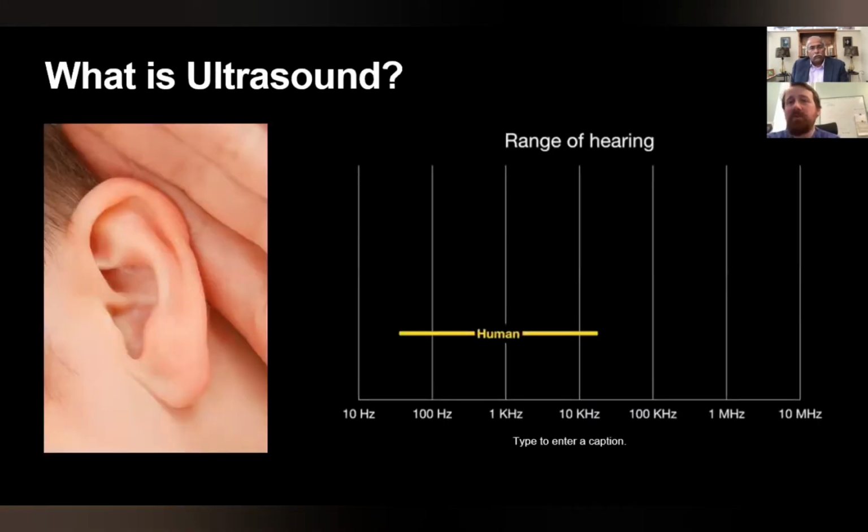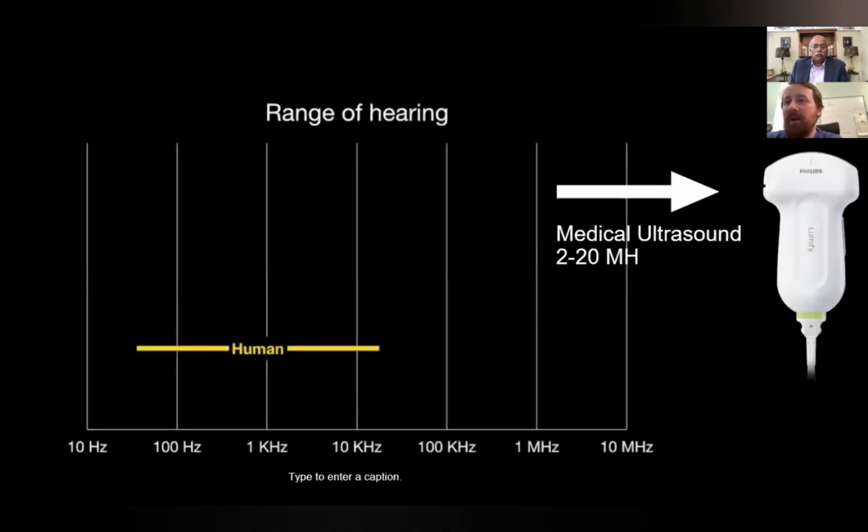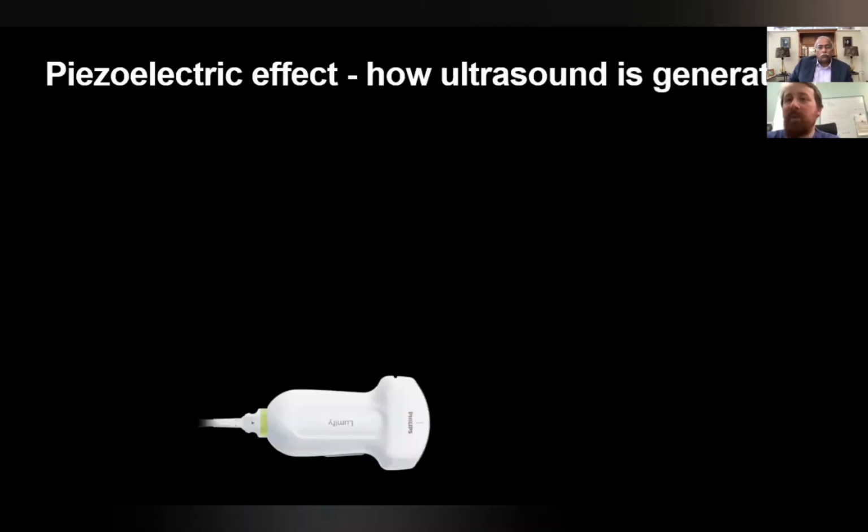Okay, so ultrasound is very simply described as just that. There's something that we as human beings somewhat arrogantly refer to as the range of hearing, and any sound that is above that in terms of its frequency is referred to as ultrasound. We can hear up to 20 kilohertz. Bats can hear somewhere between 20 and 200 kilohertz, and then we have diagnostic ultrasound. Medical, diagnostic ultrasound is somewhere between 2 and 20 megahertz. This is the range of ultrasound that we use, and we'll come on to how the range affects how you use scanning.